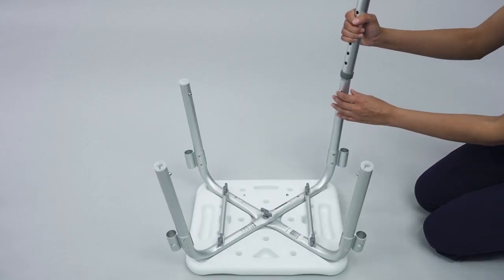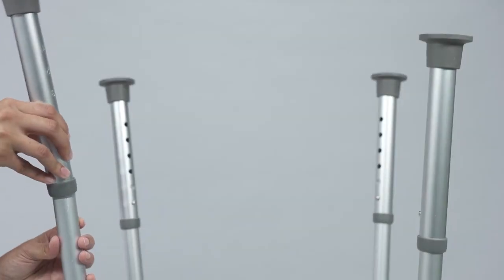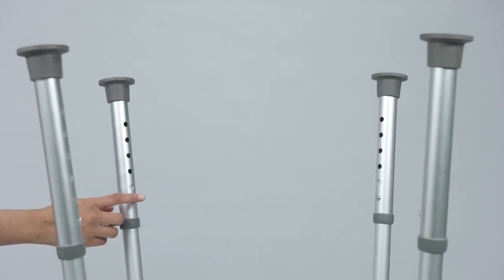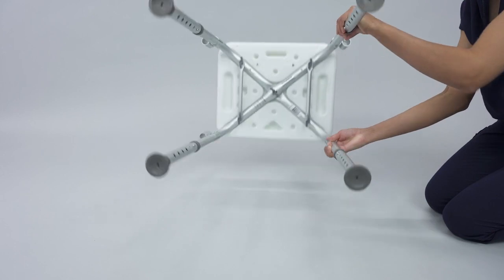Insert a leg extension piece on all four legs of the mainframe. Depress the push button and adjust each leg extension to the same height on all four legs of the mainframe. Check that all push buttons fully protrude from the mainframe. Stand the chair upright.